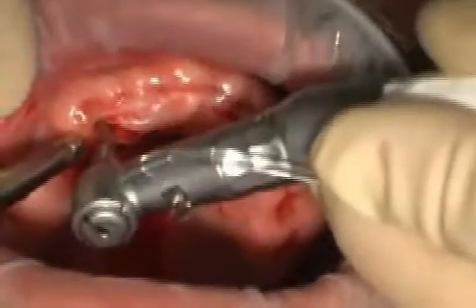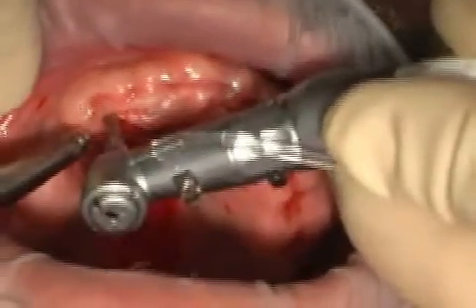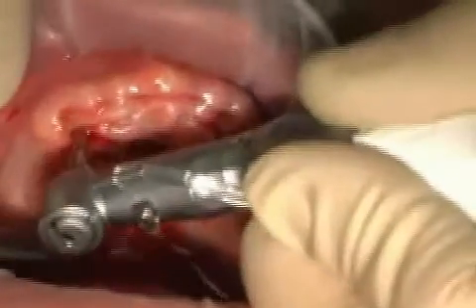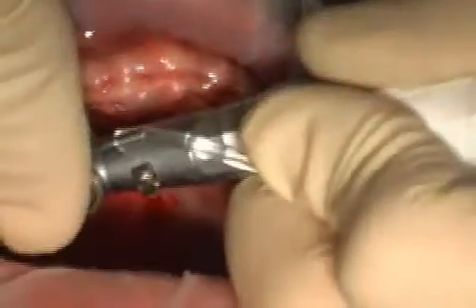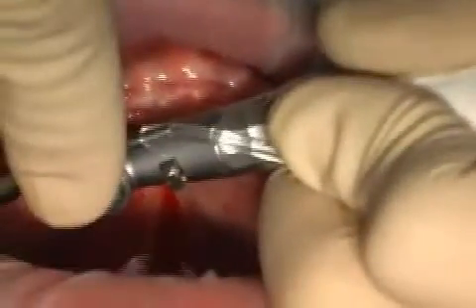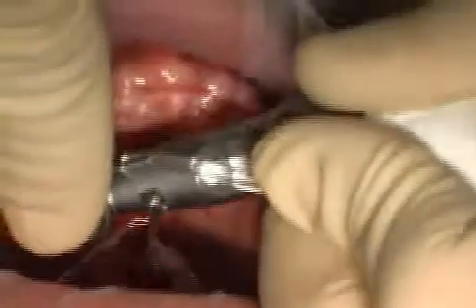In the past, it was thought to be important that implants were set into the bone in the same way as one's own teeth. Today we know that this isn't necessarily required — rather, the orientation is geared more towards the available bone. Nevertheless, one still tries to place the implants as parallel as possible, because this makes the technical provision easier.